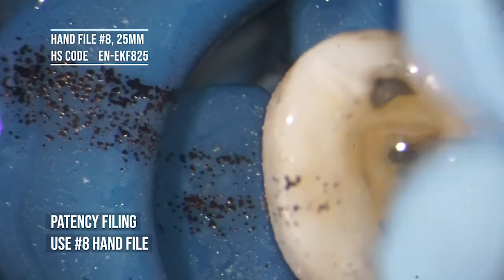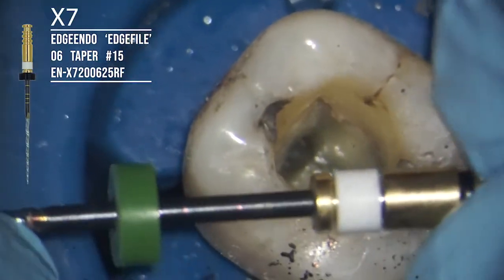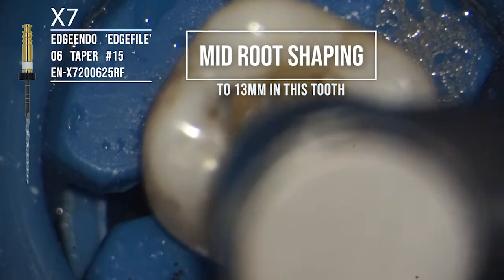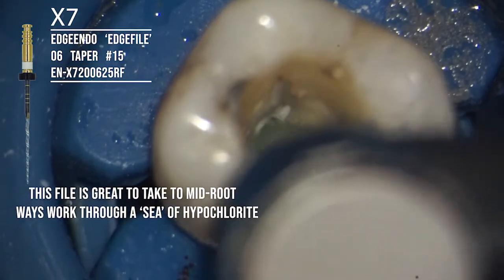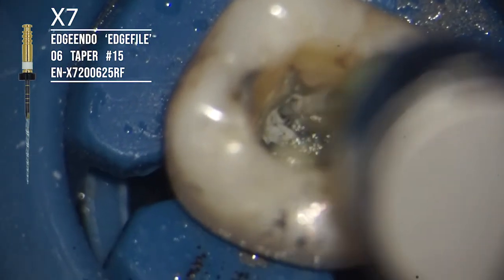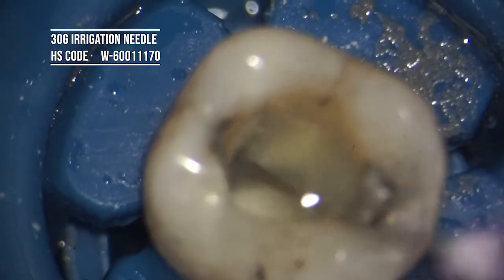A nice little tip is when you get a little bit further than mid-root, or actually get into working length, you can use an 06 size 15 into the mid-root portion of the canal. Here I should be working through sodium hypochlorite, but I just wanted to show you the debris that this file can pull up. Brushing towards the buccal. Buccal canal, brush towards the buccal, lingual, brushing towards the lingual. And that 06 just opens up to mid-root.